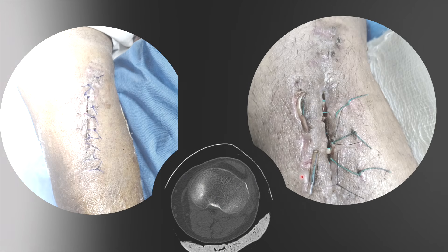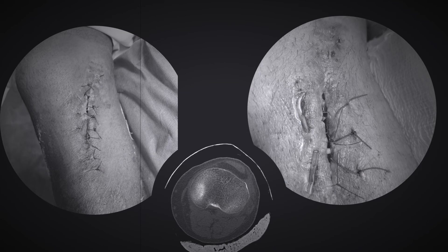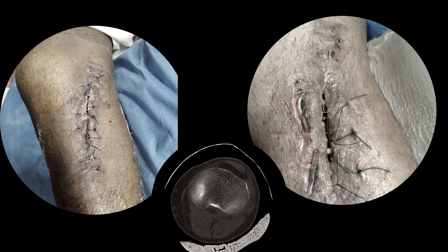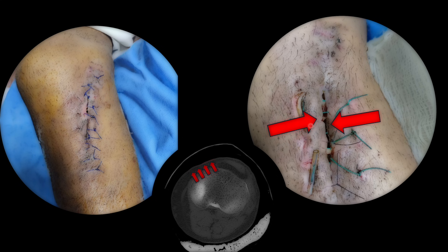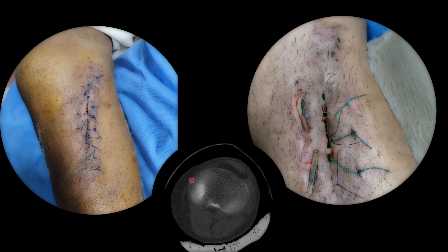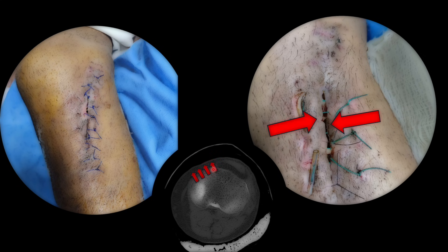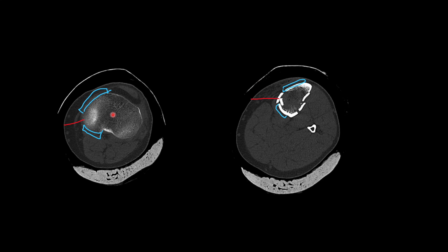You have to carefully plan your incisions. In this example, the incision is placed on the anteromedial side of the proximal tibia — the shin part — and the surgeon is trying hard to approximate the skin but cannot despite all attempts. The circulation of this skin layer comes from the base, directly from the layers close to the bone. If you have placed a plate there, it hampers blood flow to this layer so it will not heal. You need a vascular bed on which the soft tissue can heal.